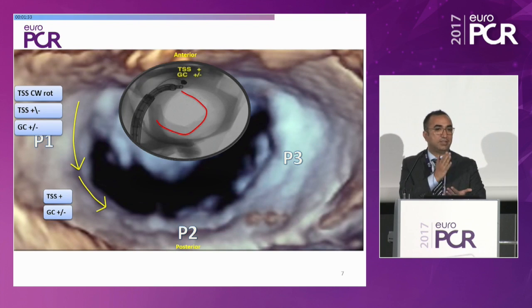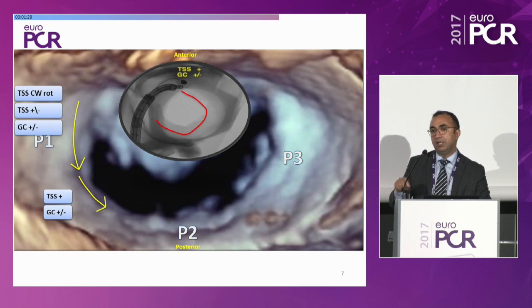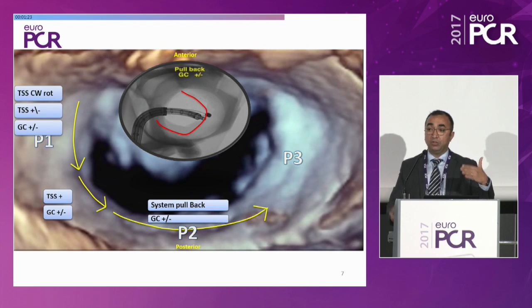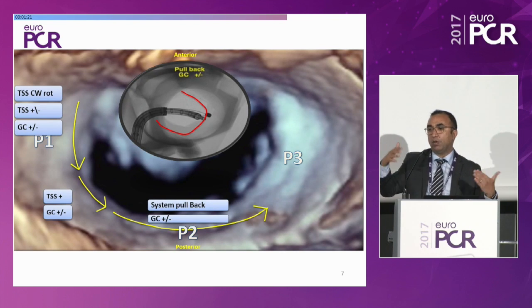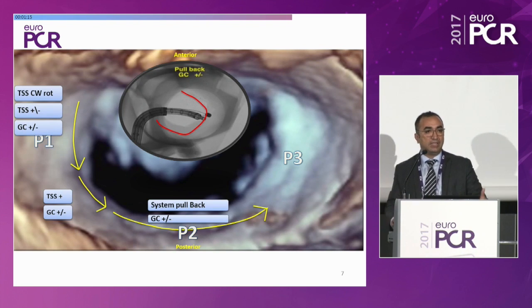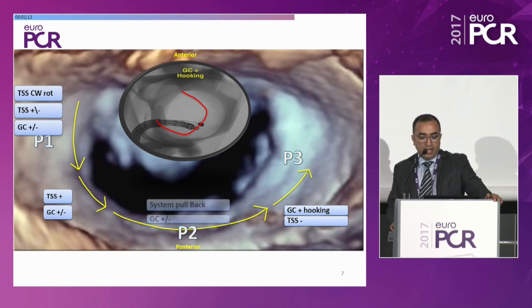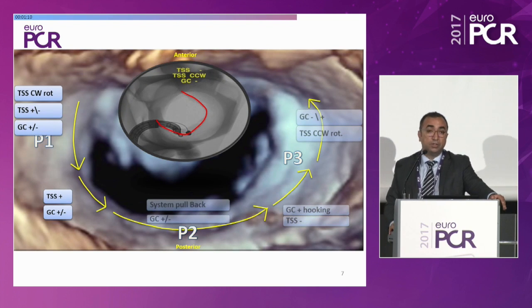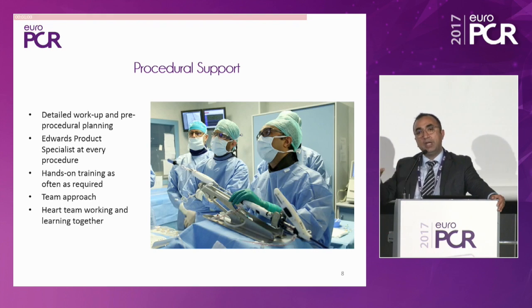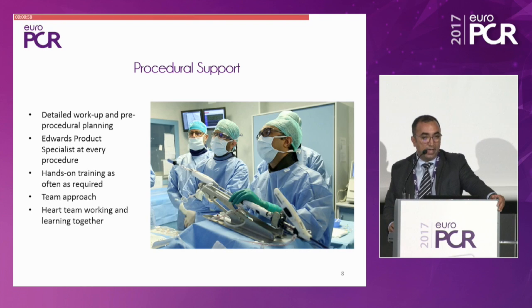He has a book. It's his playbook that says step for step, this is what you have to do. This is the part of the catheter you turn in order to get from point A to point B. And so you can do that, and you have this chart. And I actually had this chart pinned up while I was doing the case to remind myself exactly the steps I needed to do, even though I had a proctor there. And so that gives me the third part, the proctor. When we did these cases, we had a non-physician proctor help us, and it was really useful because they see all the procedures, they do a lot of procedures, and this was really useful in showing us how to move around the annulus.